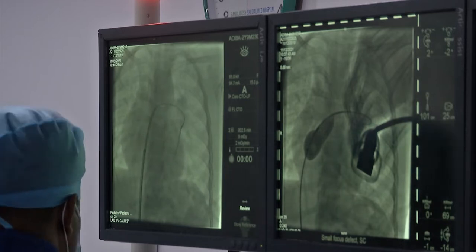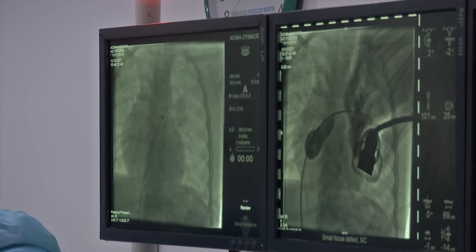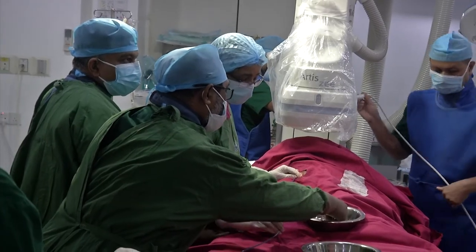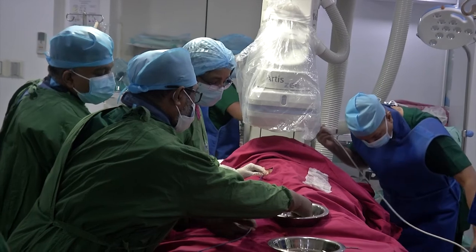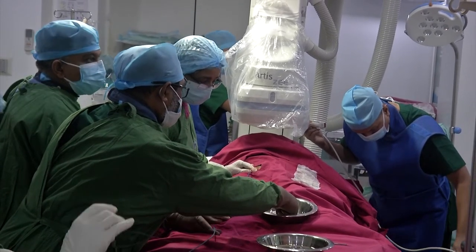So we were actually waiting for some time to see. I was seeing that there was too much depth on the contact side. So I just checked whether there was any arterial puncture or not. So in every place you have to be careful. If you have anything in mind, you have to check that and then you proceed. So we did the blood gas analysis. Saturation is 70%. So it is venous.